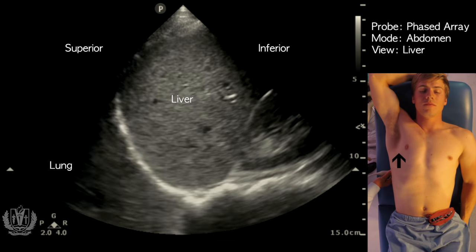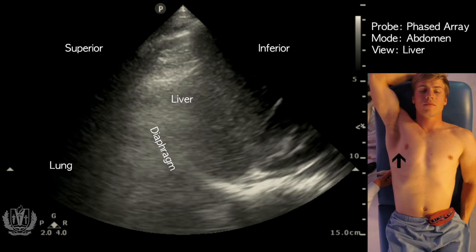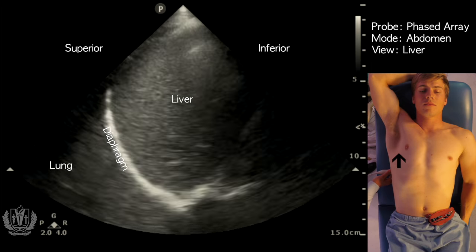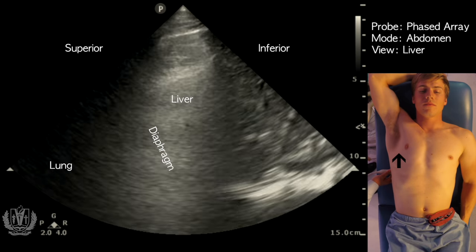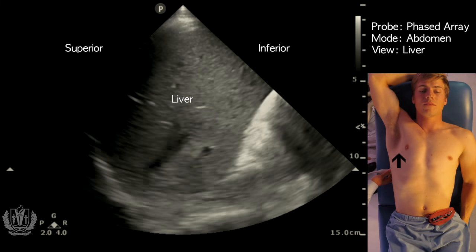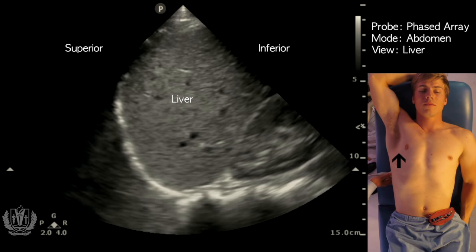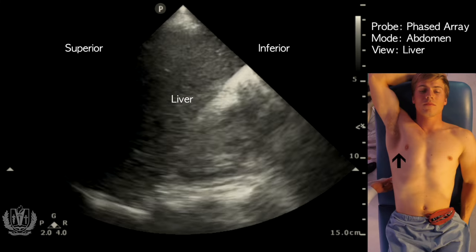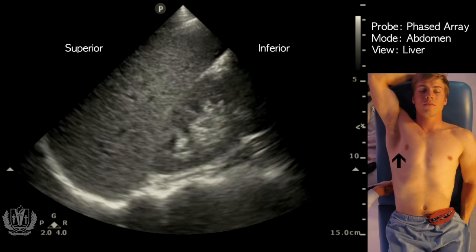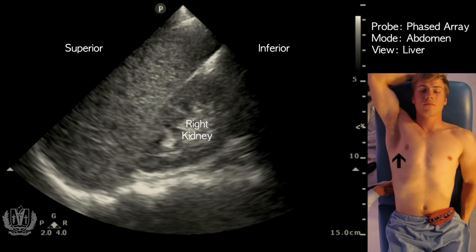Below the lung is your diaphragm — that hyperechoic, or really bright, structure above the liver. Below that is your actual liver, and you can see its grayish appearance. Below the liver, as I scan down and push the probe more towards the patient's feet, you can see the right kidney.